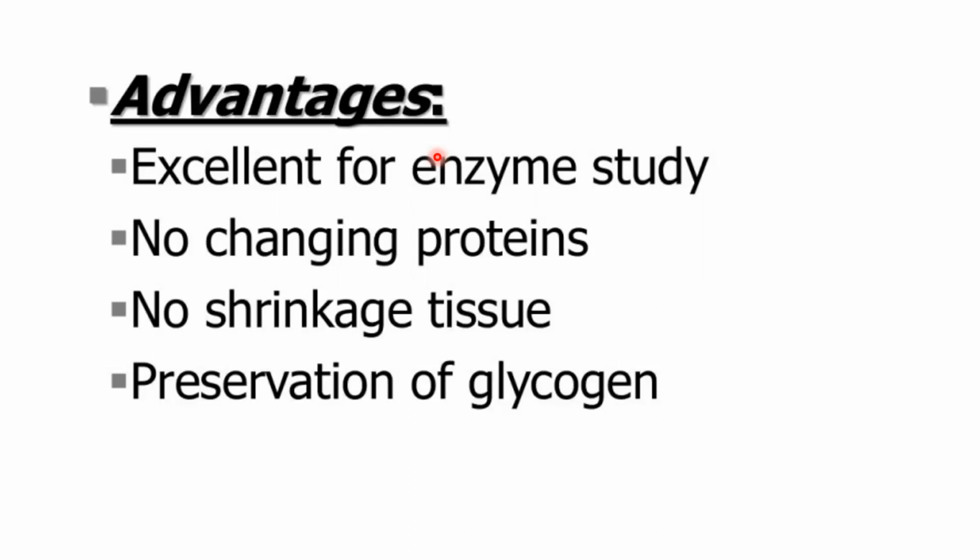But yes, there are also a few disadvantages. One of the disadvantages is that the tissue morphology won't be as great as in classical histopathology, with classical fixation. The morphology will be slightly blurry, but still it is sufficient for us to study the preliminary stages of the cell. The basics of the cell can be identified with the help of this freeze drying.